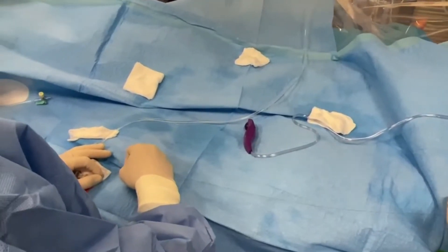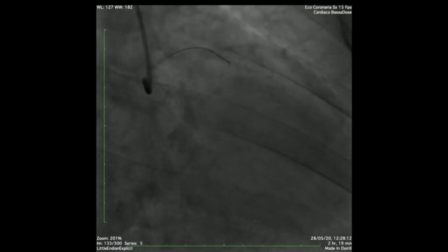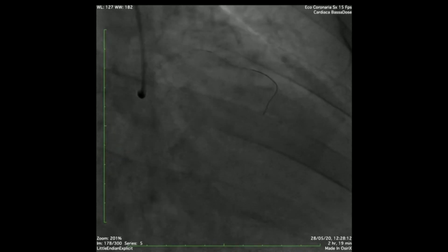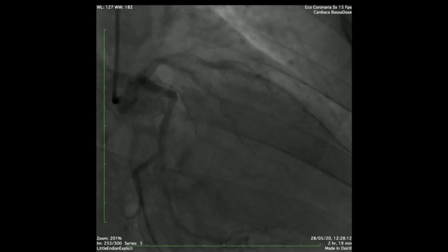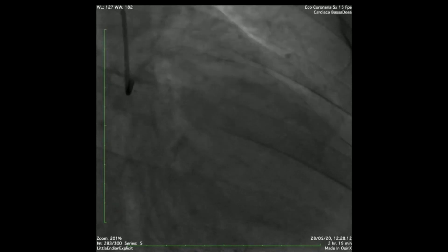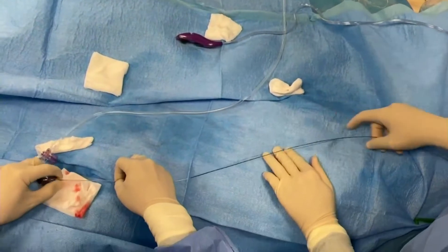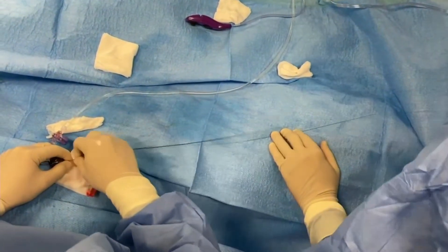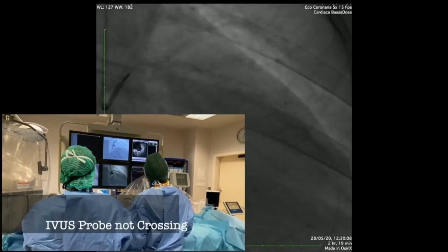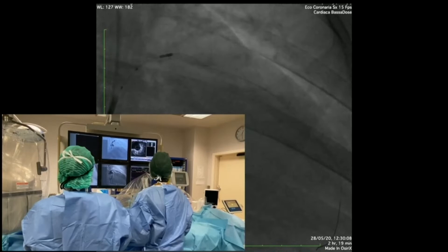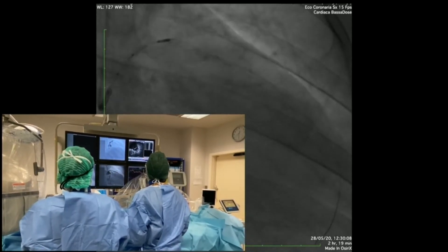This is the first step — to guess what is inside the artery. If you suspect it's calcium, you should go with intravascular imaging. This is the Eagle Eye Philips IVUS catheter after crossing with the workhorse wire. My preference is the Pilot 50. The IVUS catheter from Philips has very good pushability — it's not low profile, but has good pushability. As we suspected, it did not cross the proximal part of the LAD, confirming that it is a brick of calcium in front of it.